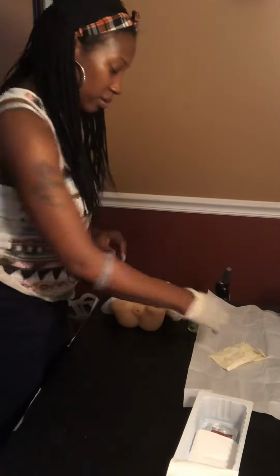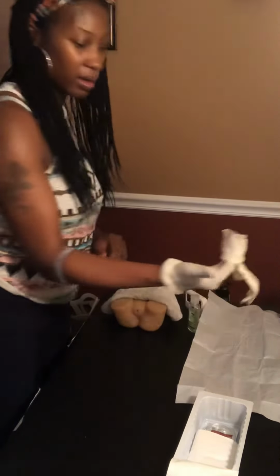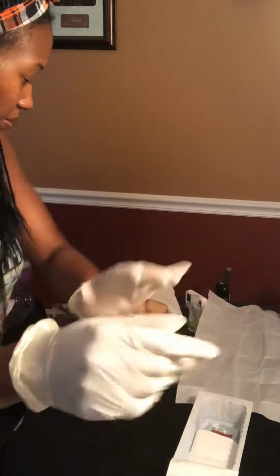Put my hands in there. Only touching the cuff. Grab the other one. 2, 3, 4 fingers under the cuff. Got it in there. Good.